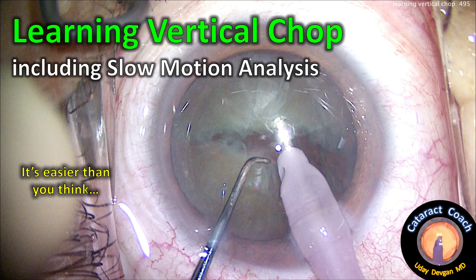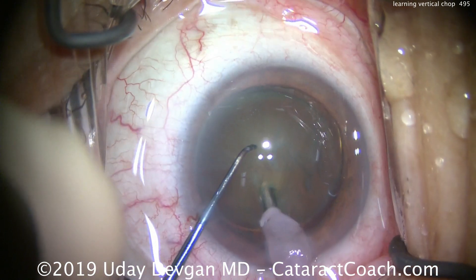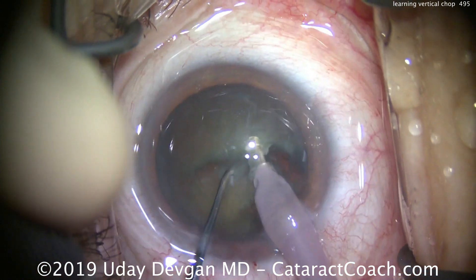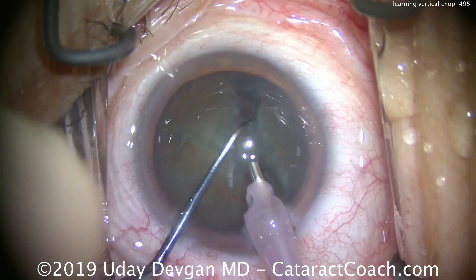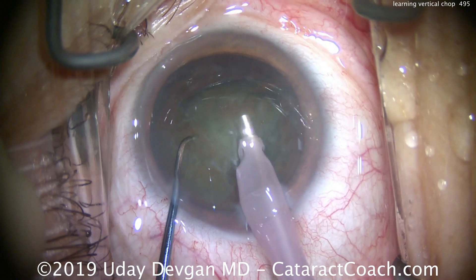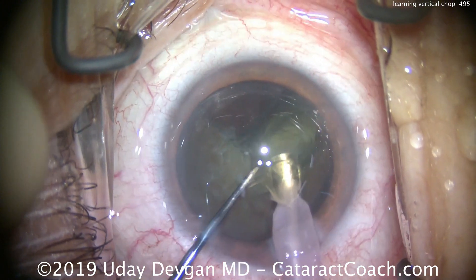CataractCoach.com — learning vertical chop, including a slow motion analysis. This really is easier than you think. I'm going to teach anyone how to learn this technique. Watch it in real time: buzzing in, and we can split the nucleus just like that. It looks so easy, and because it is — as long as you have a good instrument. You can use the chopper I'm showing here, but almost any chopper will do.